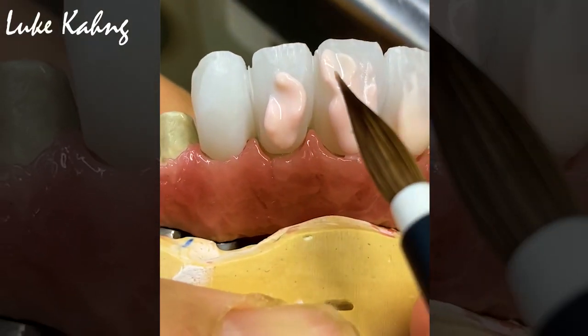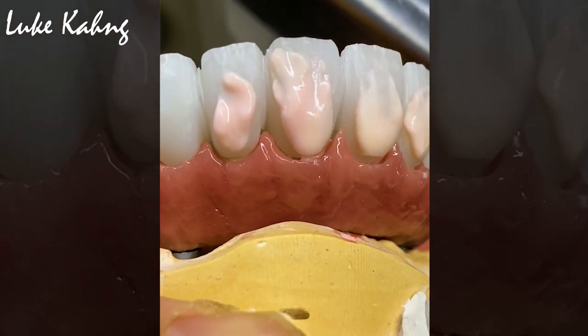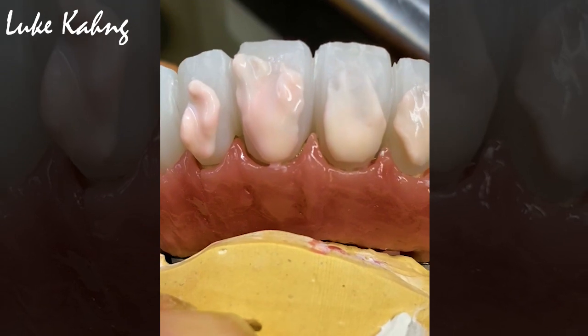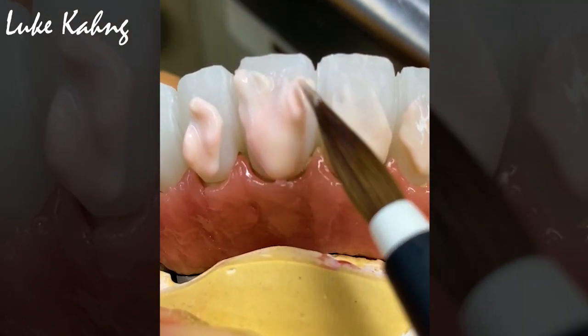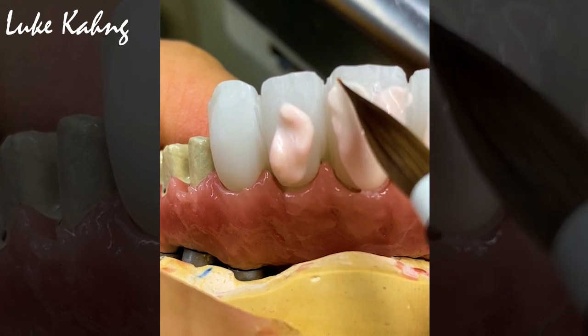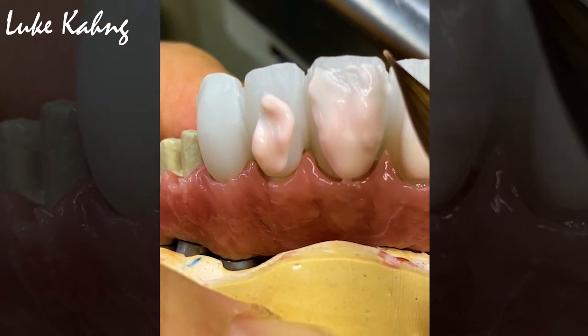And it's a little bit more dentin in the body area. However, inside the shell I utilize with a mamelone with translucency. So see — it's very thin at the top. Zirconia already has a good color, which is the base ground. So that is our dentin body build-up.